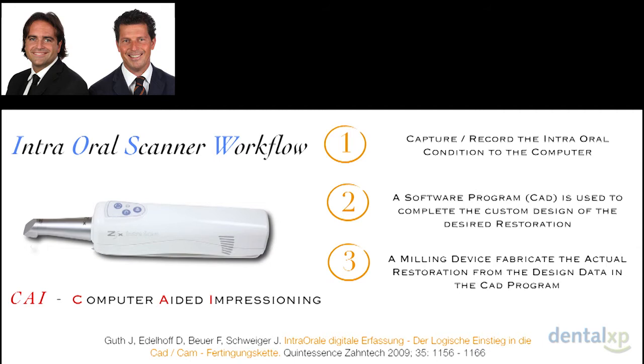So we have these 3 steps. Of course, the first one is to capture and record the intraoral condition to the computer. These data are then sent, thanks to an iCloud platform, by email to the dental technician, who with the CAD and the CAM part will then produce the final manufacture.